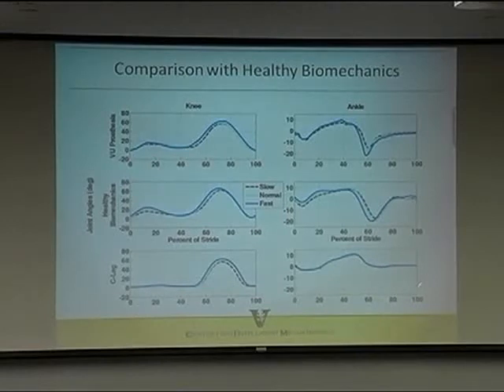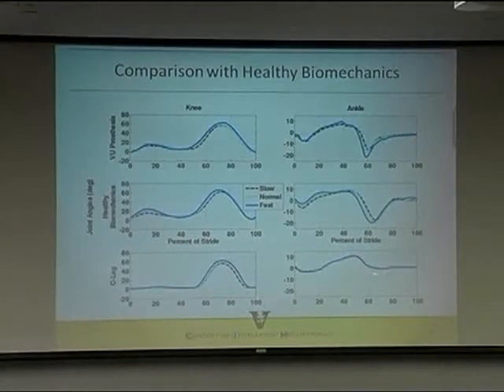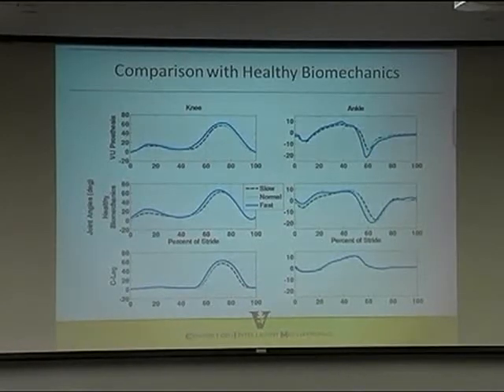By the way, some of this has to do with our healthcare system in the U.S., but this is about a $60,000 leg, the state-of-the-art one. You get essentially no knee flexion during stance. You do get knee flexion during swing. Incidentally, it doesn't actually look like these two, and the properties are different at the 3 different speeds. And at the ankle, you get almost nothing at heel strike and essentially nothing at push-off as well. So we're able to reproduce a much closer approximation of healthy biomechanics relative to the state-of-the-art.